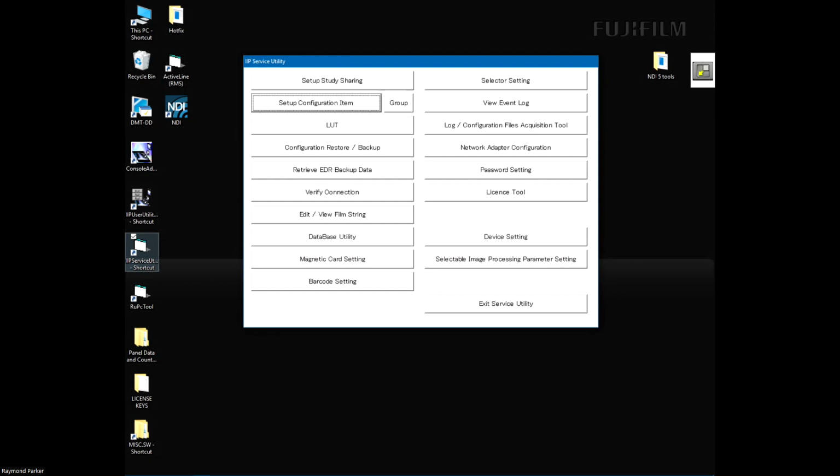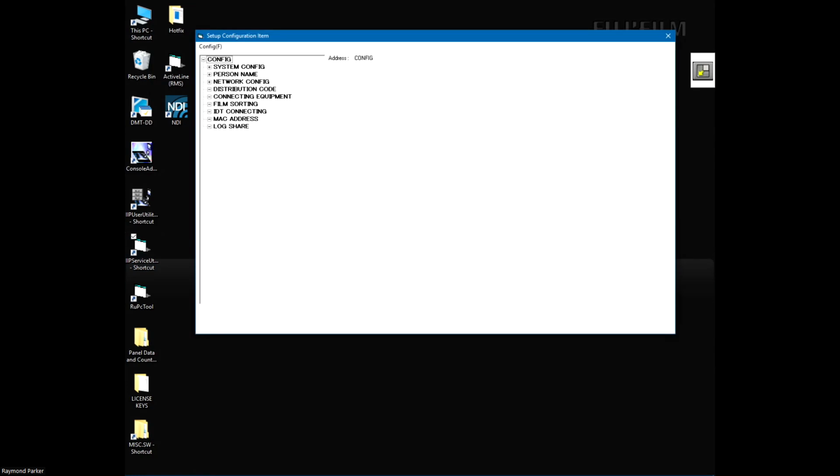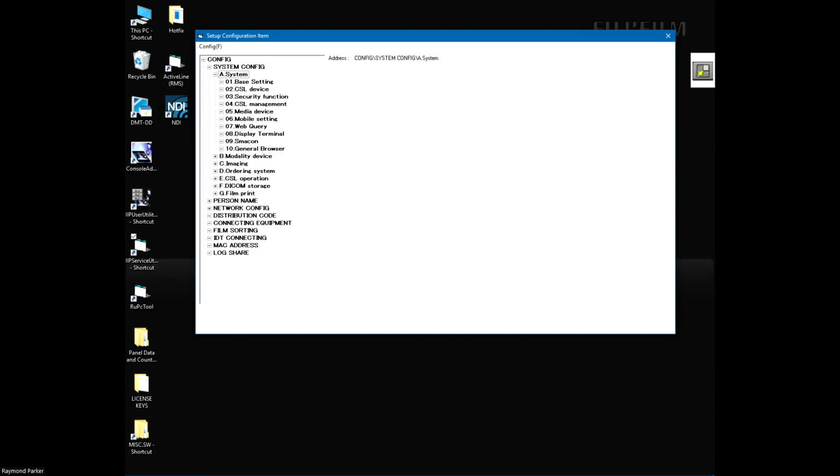Obviously, all of the trimming, copy image function, all of those service utility setups in a prior video should be set up. I wanted to make sure, though, in this instance that I hit 2 specifically. The first one being our security function. When turning on the security function, I strongly suggest that you go in through the groups. It just makes it easier for you to work in them. It combines all of the functions together for you.